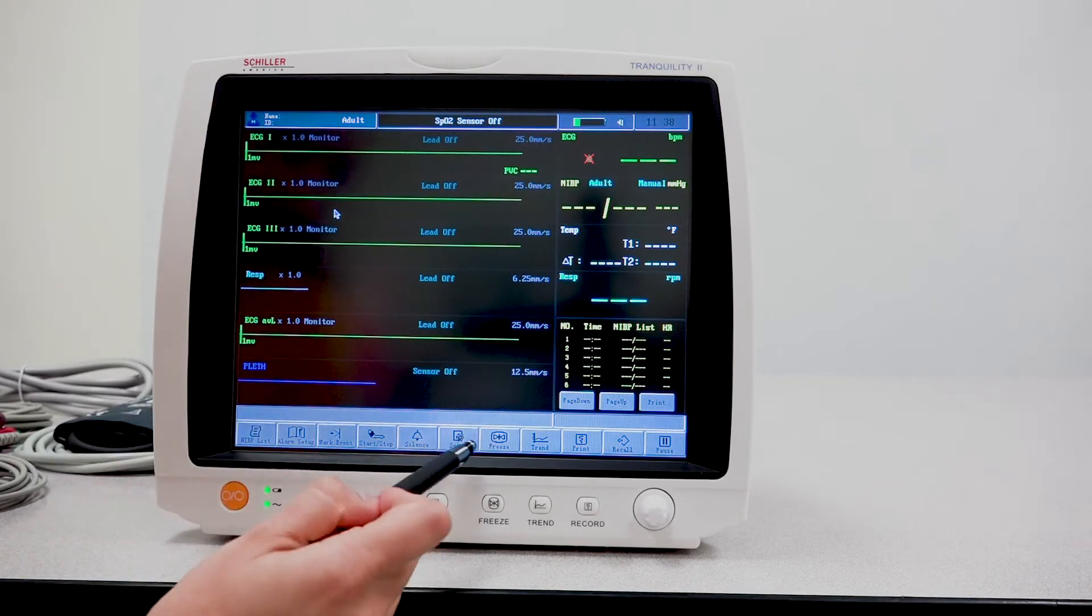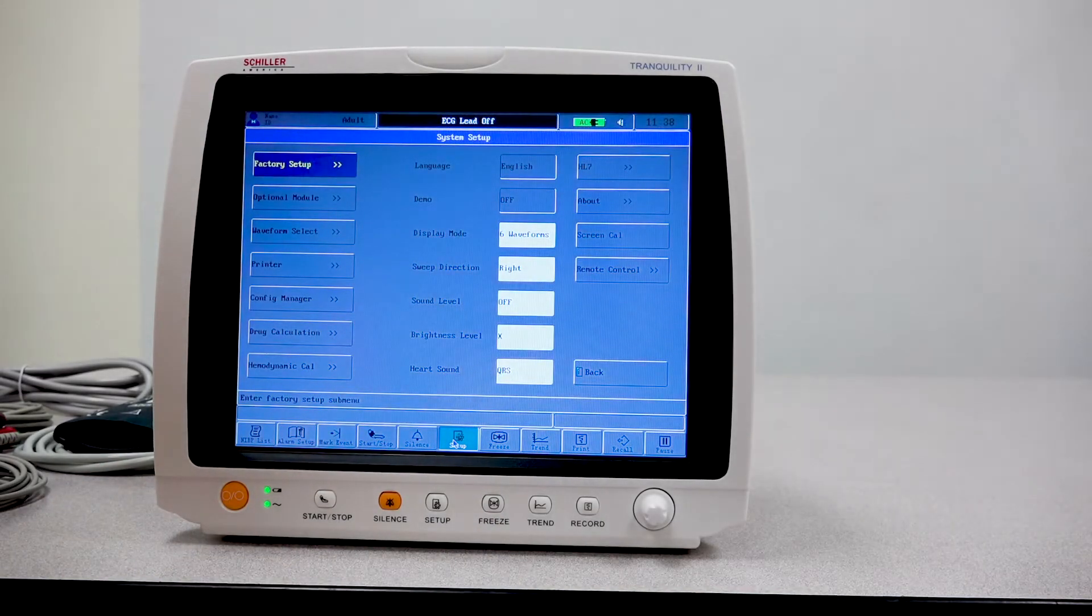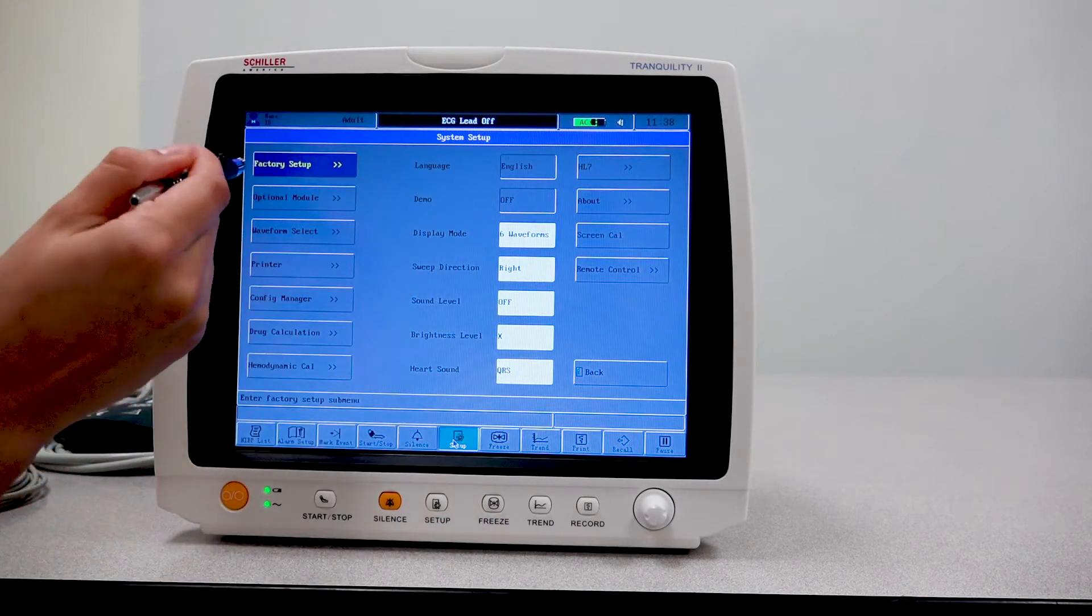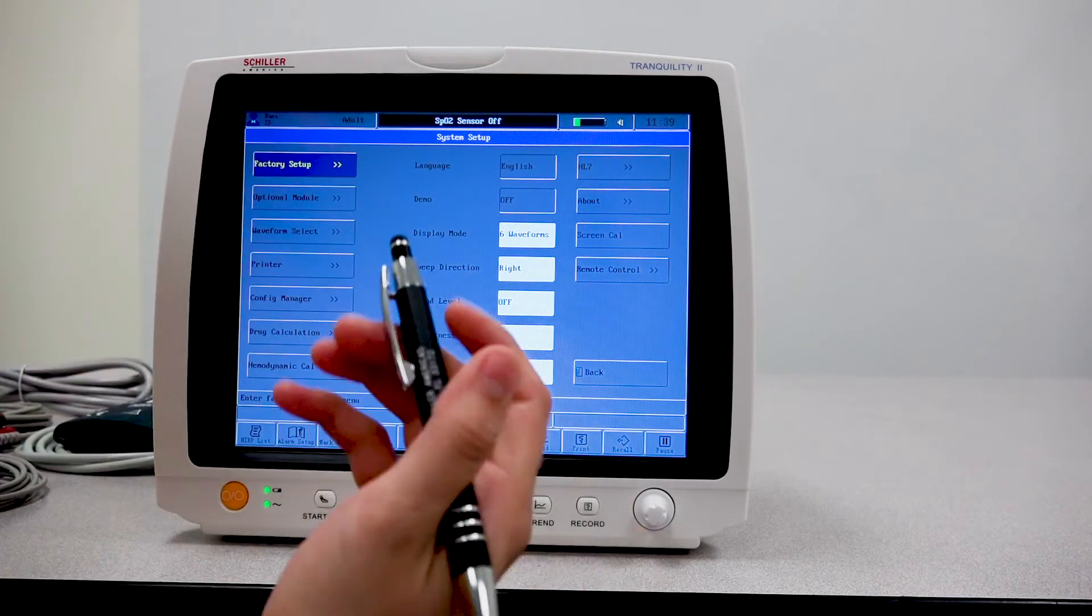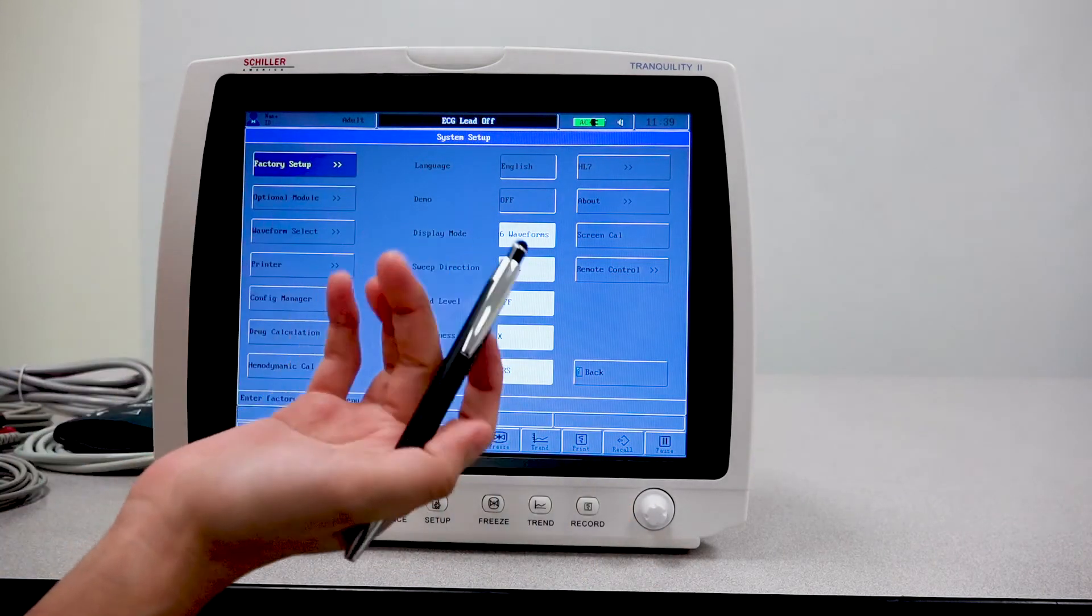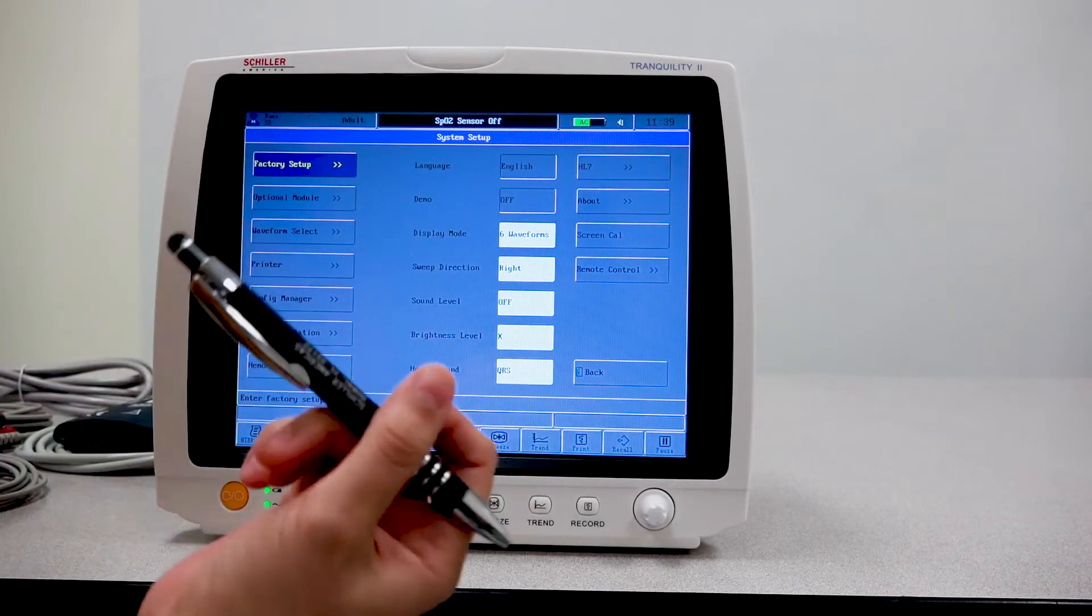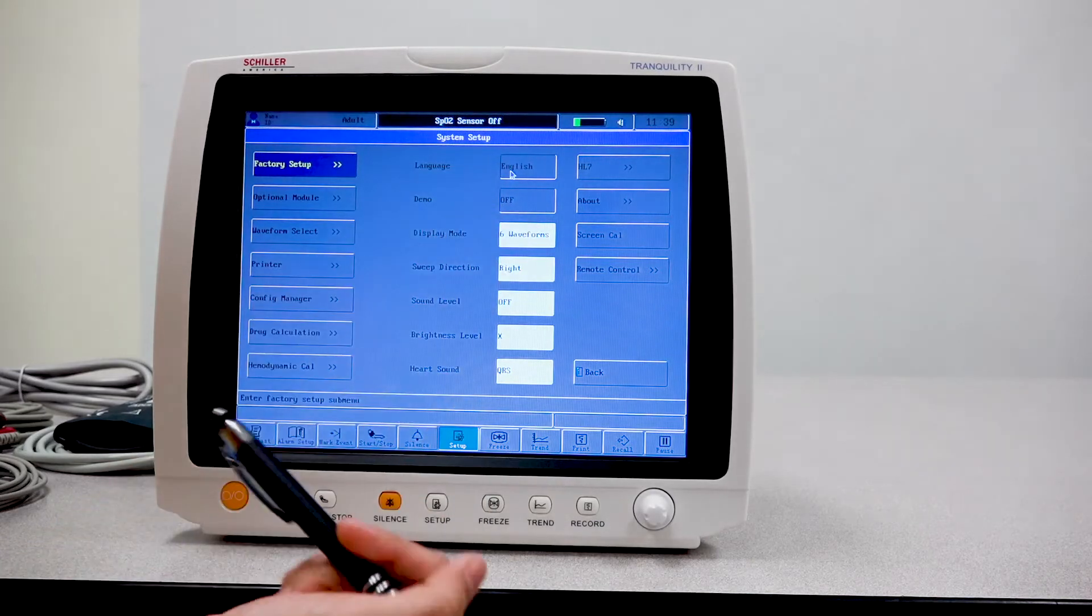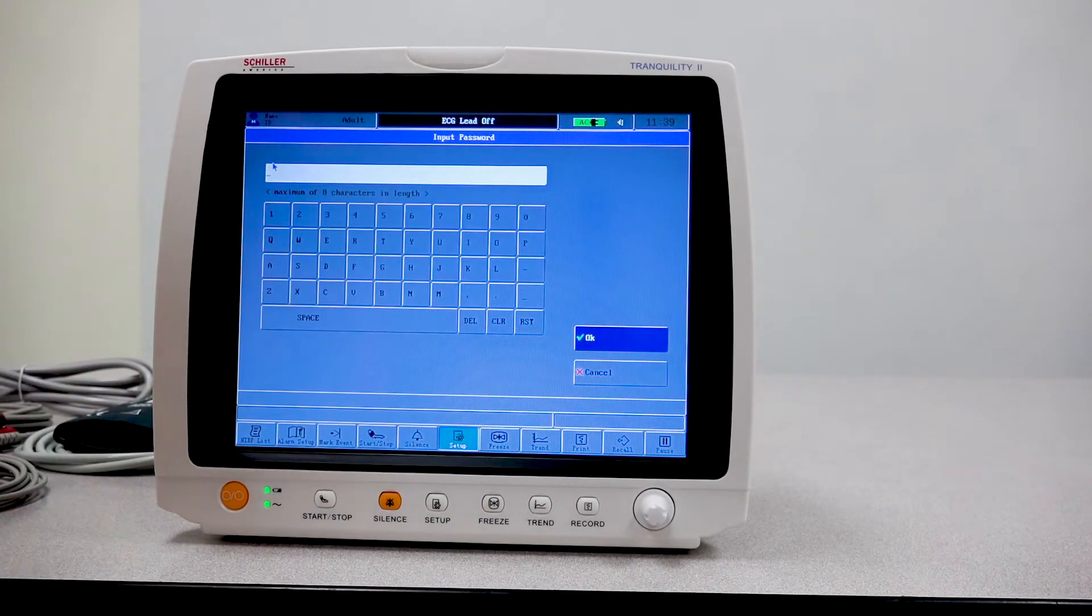Now we did have the setup section here. As you can see, there's quite a different amount of settings. Your factory setup is where you will go to change things regarding the general settings, like in this case the language. If I wanted to change the language, if you notice right now it's grayed out. I can't change it. So I'll actually have to go to factory setup.